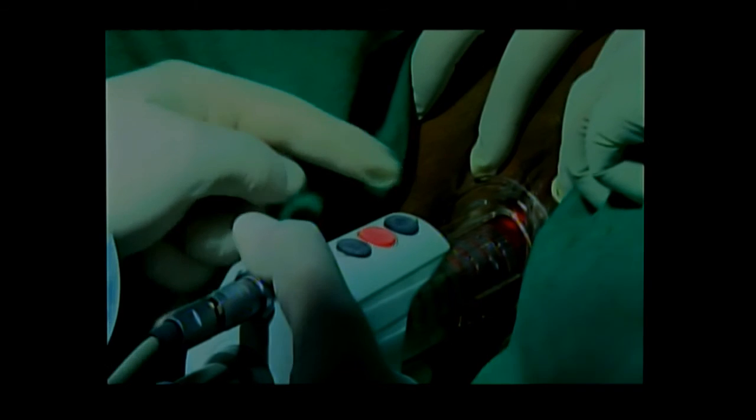And you can see there's zero, one, and two on the probe itself. That's a fixed protocol. It produces an increase in the secretion of the vagina. Some patients start feeling relief immediately because of immediate edema, then at 30 days the effect wanes off. So your second sitting comes, then she feels more relief. At day 40 she's feeling as if she's cured.